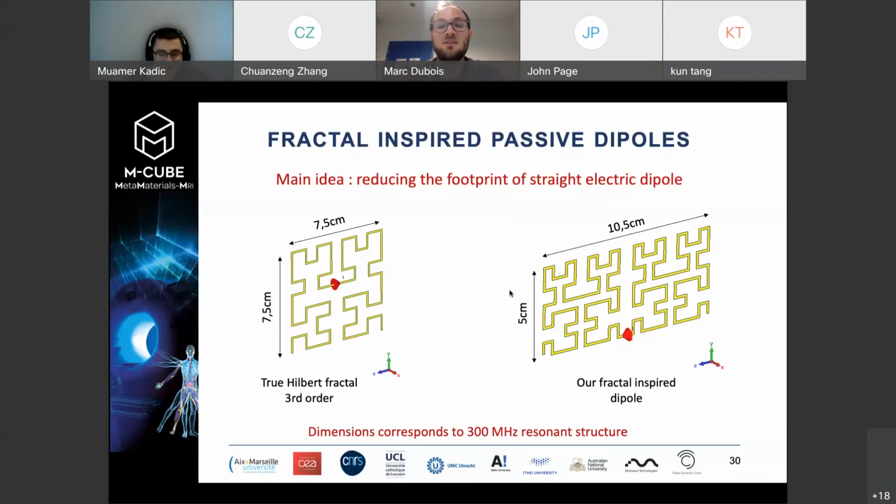But if you imagine someone with back pain or stuff like this, and you ask them, please stay 15 minutes without moving, it's really hard, right? So there is a limit in time where it's not just comfort, people will move eventually and it will mess up the image. That's a variable that you also want to gain, because otherwise the image won't be easy to read for the doctor, which is always the bottom line. If you can't do anything with the image, why bother?